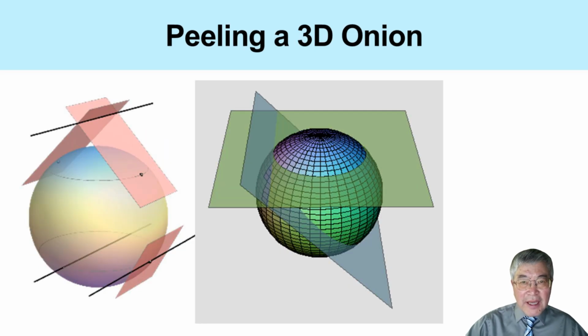Naturally, we can extend the two-dimensional onion peeling idea to the three-dimensional case. In 2 dimensions, we use line integrals to recover the object layer by layer. In 3 dimensions, the corresponding concept is based on planar integrals. Instead of thinking only about X-ray lines through a two-dimensional slice, we now think about measurements over planes that intersect a three-dimensional object. Imagine that the object is a three-dimensional onion.